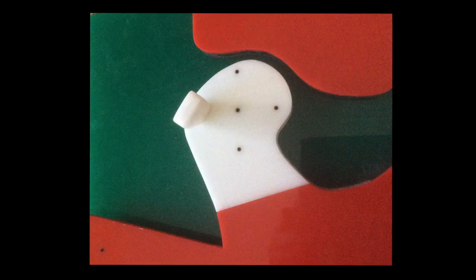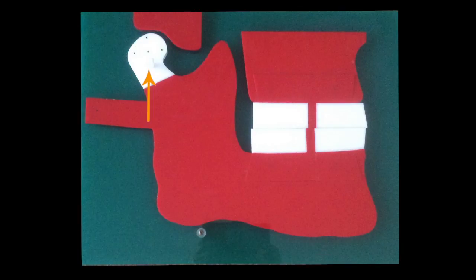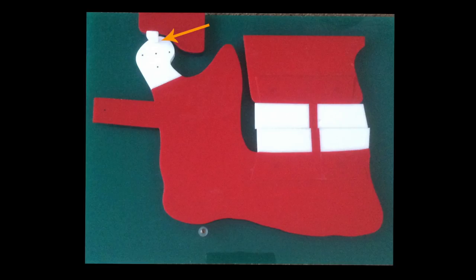It is instructive to see what type of error occurs when one is just a quarter of an inch off from the true axis. This is the error produced when the articulator axis is a quarter of an inch behind the true axis. This is what happens if it is below the true axis. If it is in front, then the occlusion will be open and back and the front teeth will be in the way. And if it's above, then the entire occlusion will be protrusive.